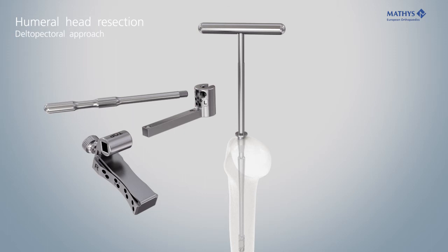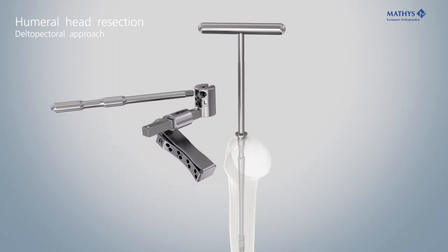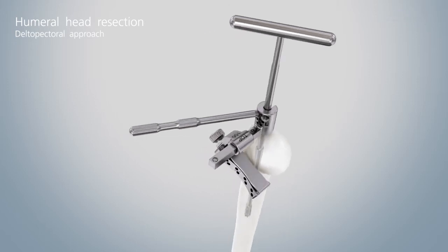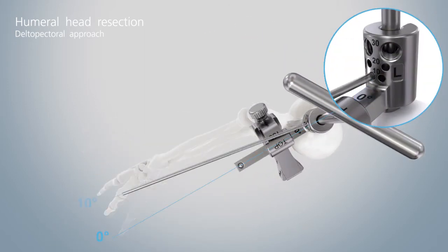Assemble the resection guide for the right or left side. Use the glider resection guide angled by 155 degrees. Set the desired retroversion by aligning the alignment rod or the Kirschner wire on the forearm.